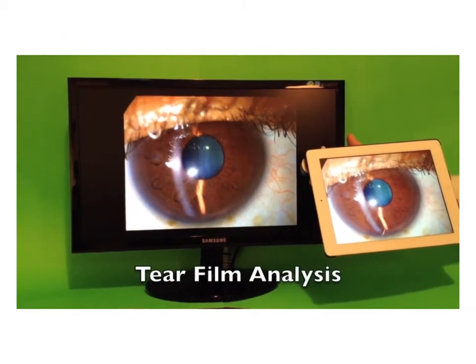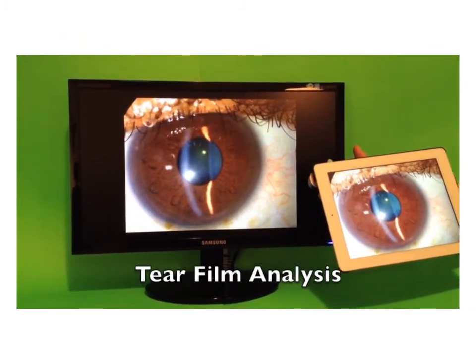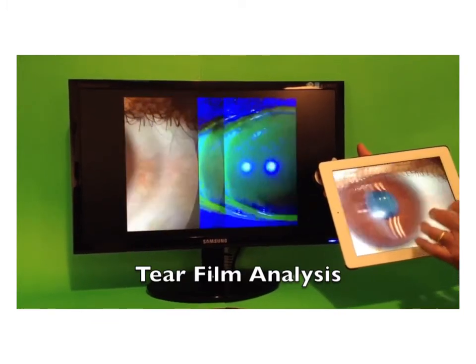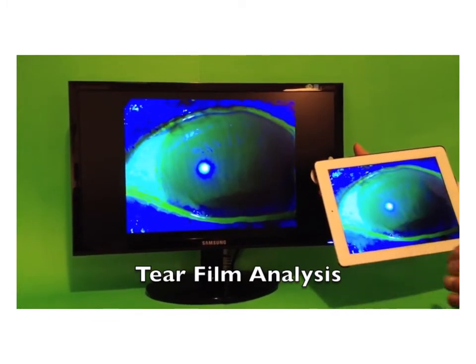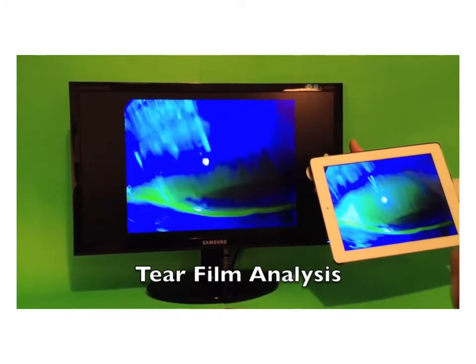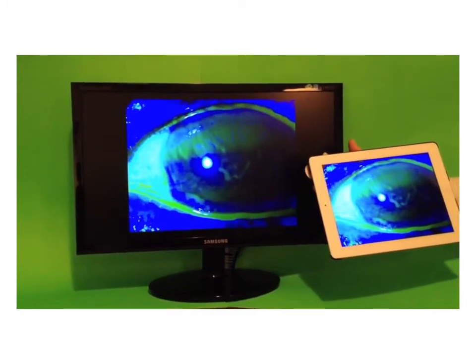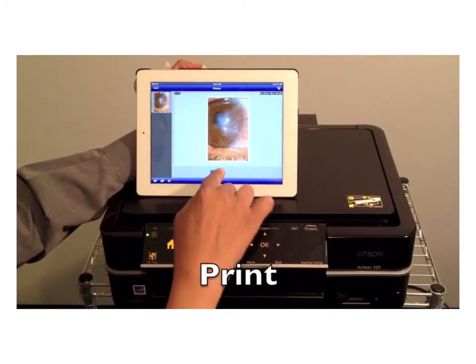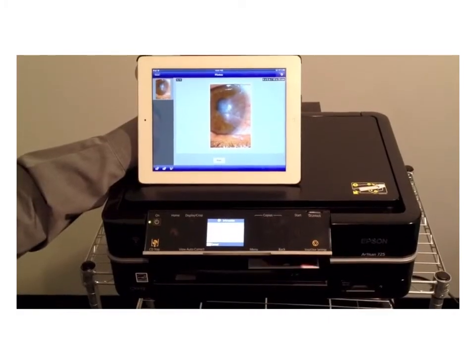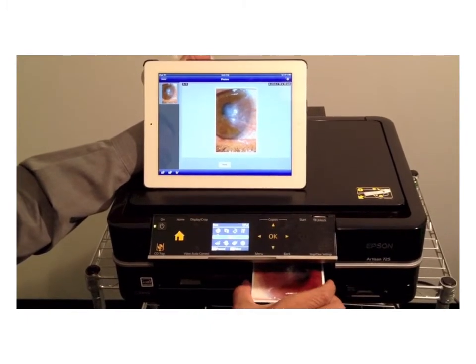Using video, we can do dynamic tear film analysis. Here you see it in a color form and there it is in fluorescein. You can watch the blink and analyze the tear film. You can wirelessly print your photos — here you see sending the photo to the printer, and here it is.